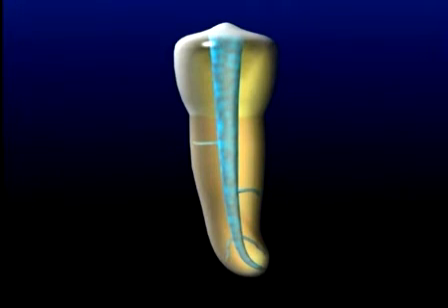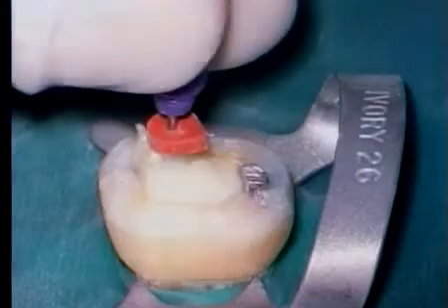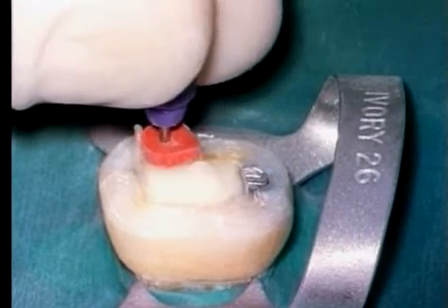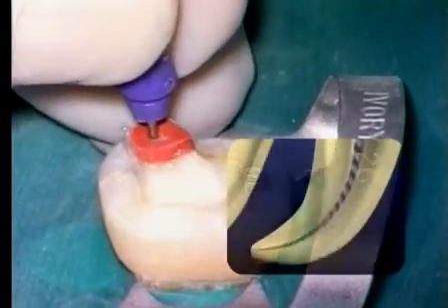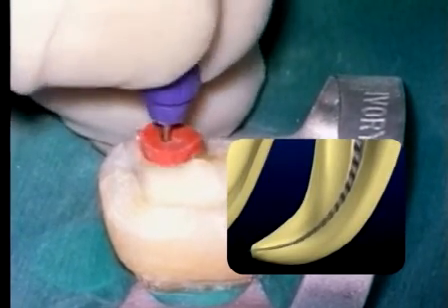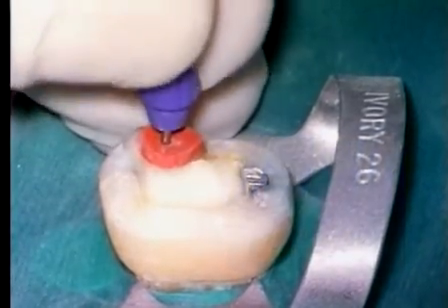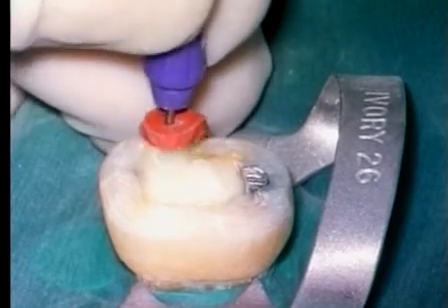Finishing is the sine qua non of excellence and is an opening for packing root canal systems in 3 dimensions. Working length and patency are so interrelated that they must be discussed together. The breakthrough to apical 1/3 finishing procedures is canal patency and is performed by gently pushing small, highly flexible files to the radiographic terminus. To ensure patency, the file tip is intentionally inserted minutely through the foramen to discourage the accumulation of debris. Importantly, working a small, flexible file to the radiographic terminus will encourage the elimination of dental pulp, related irritants, and dental mud.